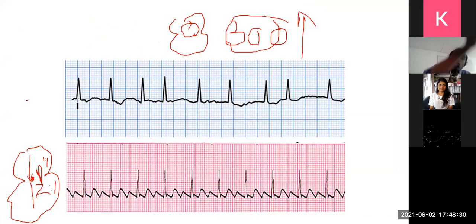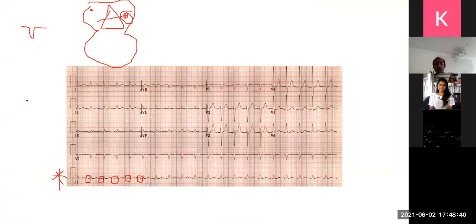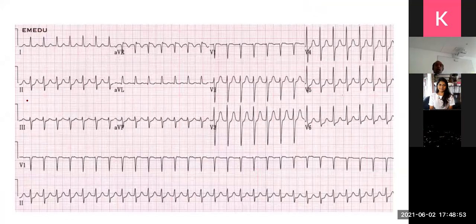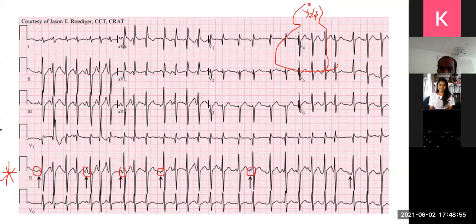A very nice sawtooth P wave due to this round and round, merry-go-round-like current that occurs in atrial flutter, or this inverted P or multiple P wave morphologies you see in atrial tachycardia or multifocal atrial tachycardia, where they usually cause a tachycardia as a result as well. Right. Now, Sajit has asked a very important question, which I will repeat.